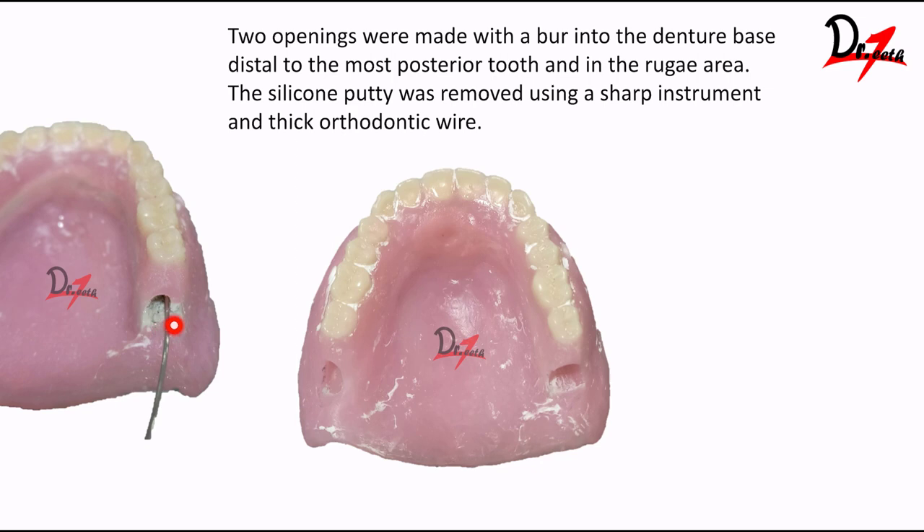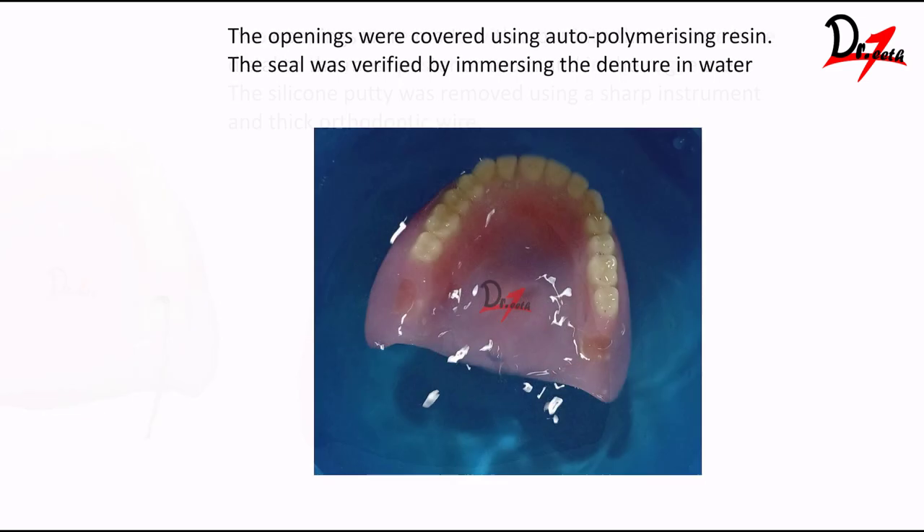On the posterior side, a hole was made. We take an orthodontic wire and remove the putty — this is a very difficult procedure. Two openings were made with a bur into the denture base, distal to the most posterior tooth. I also made one opening in the rugae area because removing the silicone from the anterior region was very difficult. A sharp instrument and thick orthodontic wire were used. After removal, we plug the openings with cold-cure acrylic — always use it in the dough stage so it does not flow inside, just making a plug. Pour it in water and the denture should float, as you can see here.